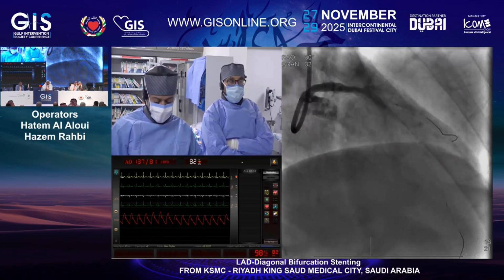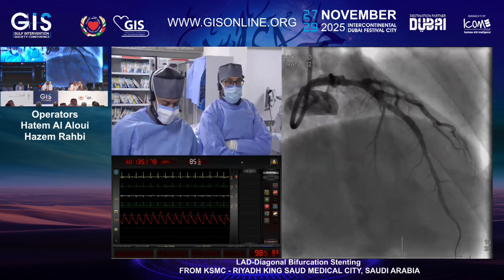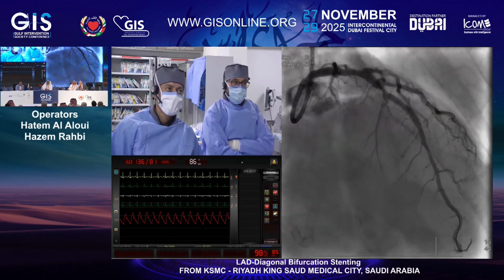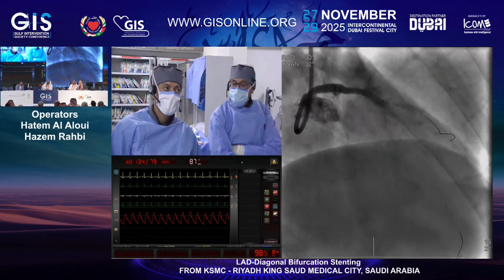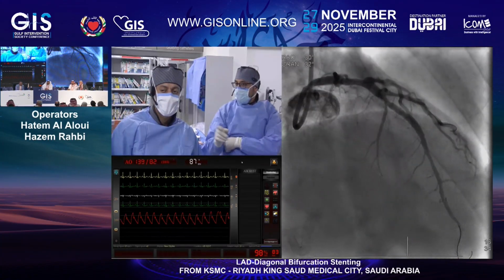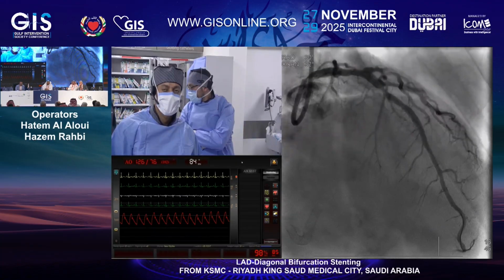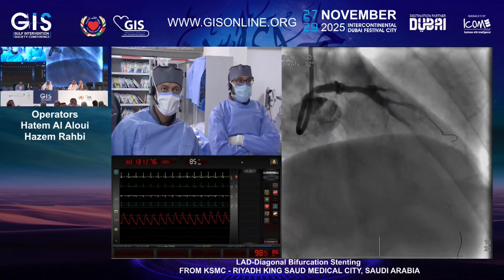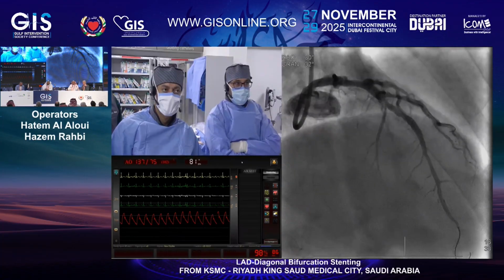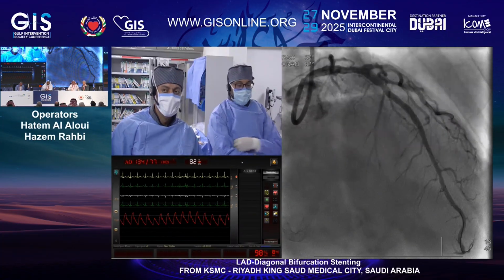And now with the new generation stents, most of them are thin struts, the Synergy particularly, so you can overlap safely. Okay. What stent can we take? What's the length if you want to use the short-stent strategy? What I measured was just over 24. So 28 probably would be good, because you've got plenty of healthy landing distally. So I think it's probably safer to take a 28.